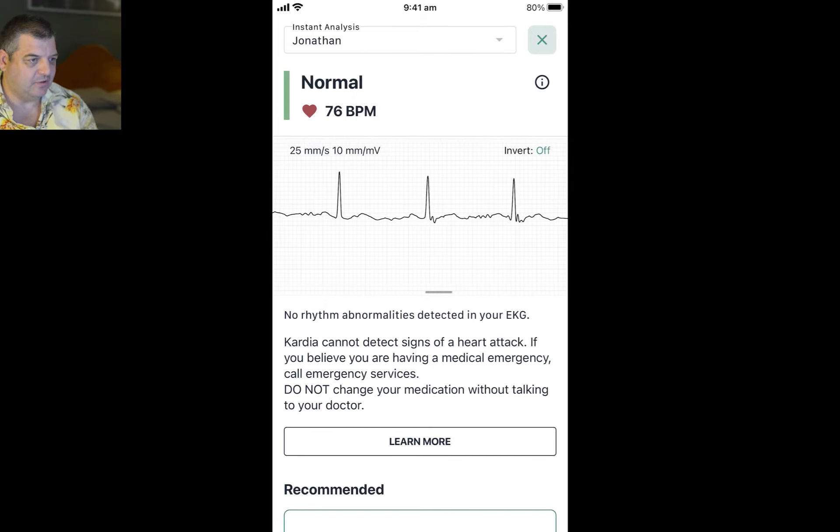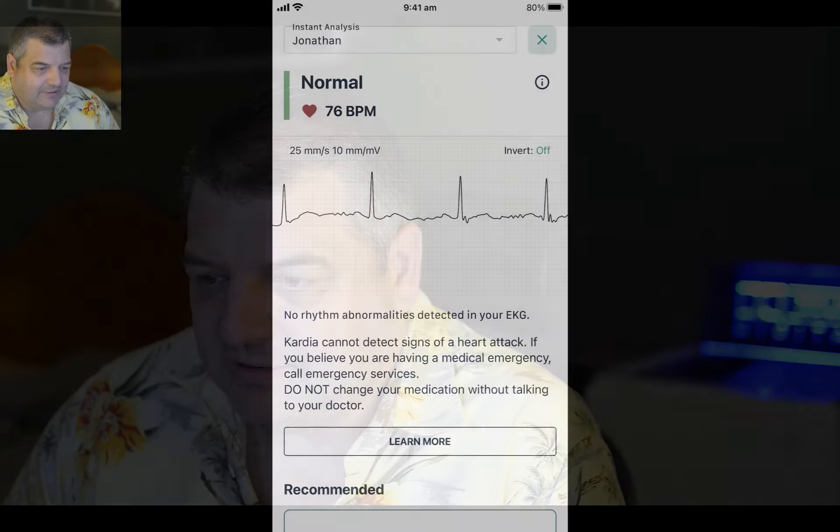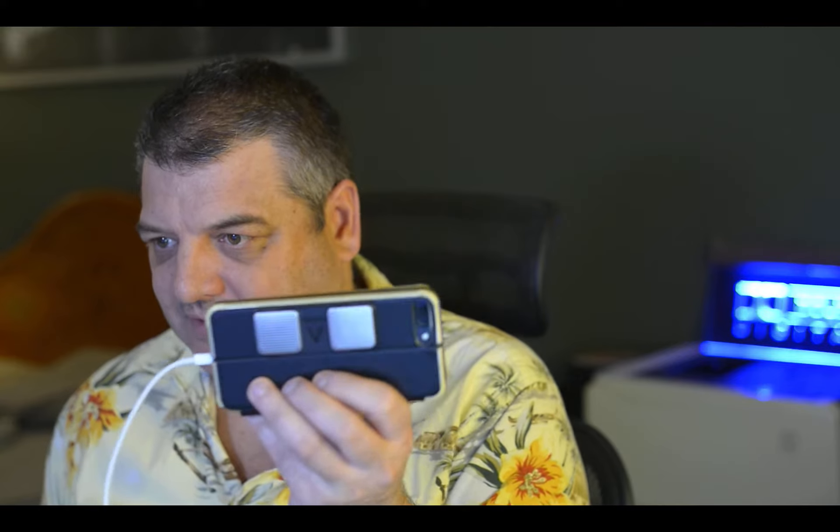But most of the time it does work on the phone as well. So there we go — it's a cool little device. I totally recommend it. It's only like a hundred dollars I think. As you can see it just fits on the back of your phone in a little case.